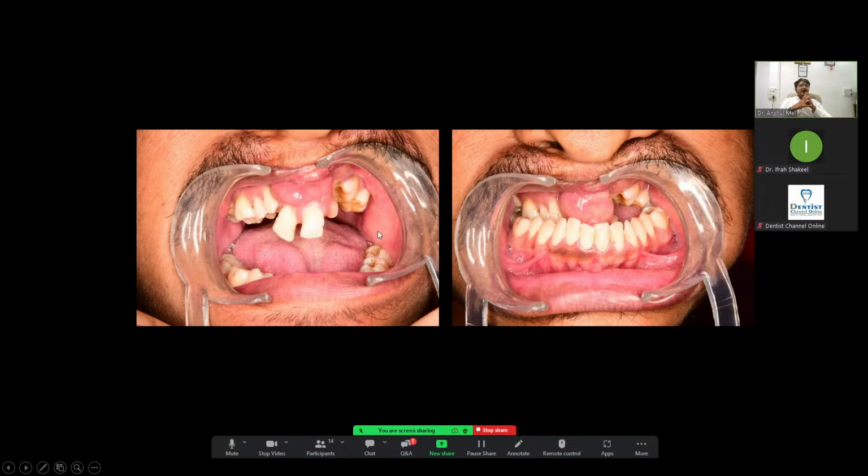Now the most common question which I am getting is: doctor, we have cases where we have done the mock-up, everything, a digital mock-up we have done. Now we want to give the same occlusion in the final, but we already prepared everything. So now how will I superimpose the same occlusion or give the same occlusion in the final?